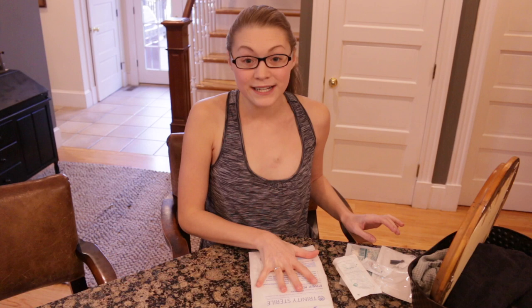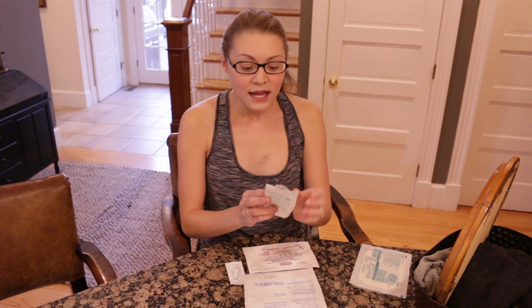I'm going to need my dressing change kit, which has gloves and the sterile field and all of that. A Huber needle — the needle I'm using today is a three-quarter inch length, 22 gauge. It'll work for the monthly flush; I just don't prefer this style of needle for a week-long leaving it on my chest for IV antibiotics. I like to get a six-inch or longer IV extension to put on the end of the Huber needle so that it extends the tubing — if I'm hooking up to my IV in the middle of a store, I don't have to hike my shirt up, the tubing just comes out the bottom of my shirt.